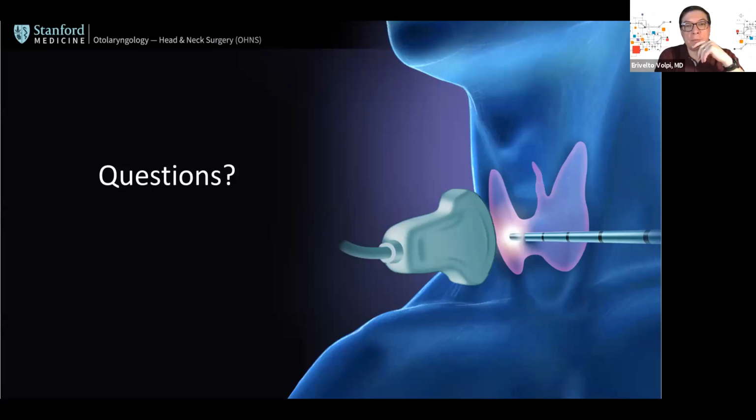Here in Brazil, I suppose Higino and Rangel have the same opinion. We treat a little bit different from other places because due to the cost of the procedure in Brazil, we try to use as much as we can. So we treat all that we can in a single session. So we usually treat 2 or even 3 nodules at the same time if possible. And we try to use the same needle for the patient as much as we could for the best results.